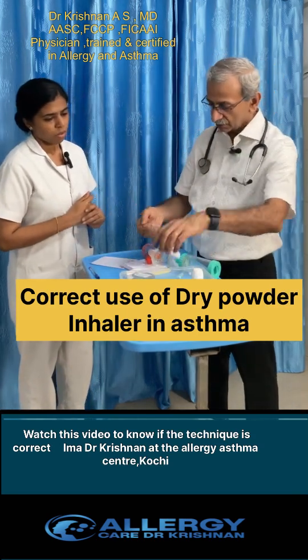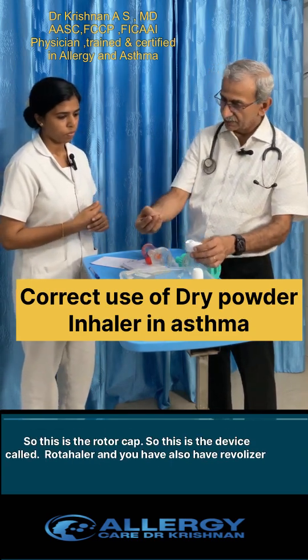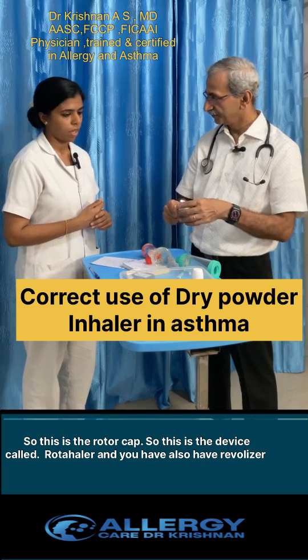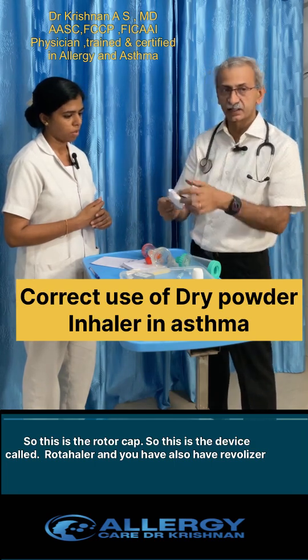I have an inhaler called rotacaps — this is the rotacaps, and this is the machine called the rotahaler. The medicine comes from the rotacaps. We take it from the cover, keep it inside the machine, and breathe it.